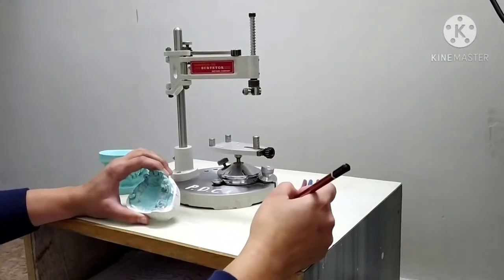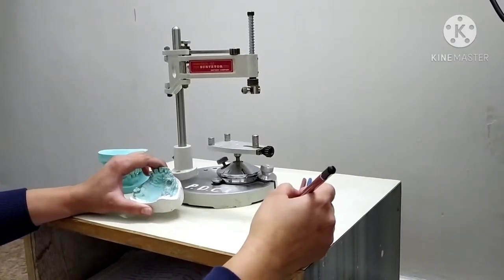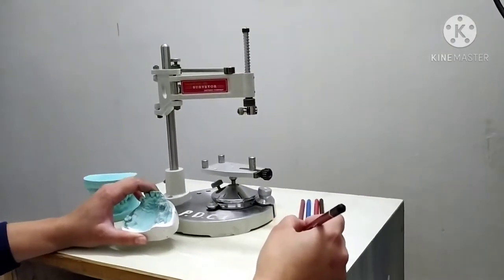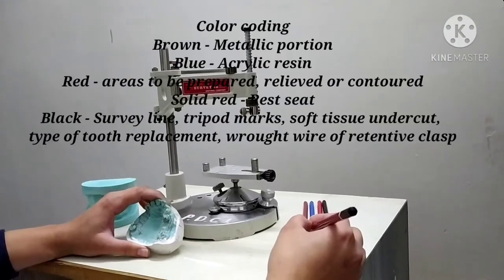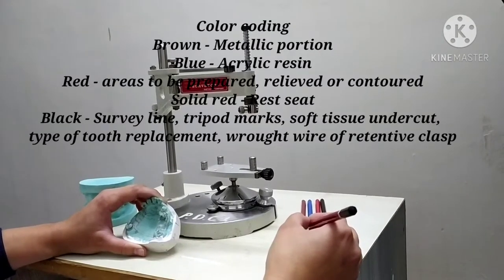Hello everyone. In this video I am going to explain about the steps of surveying procedure. Before moving to the steps of surveying procedure, let me explain about the color codings for the surveying.